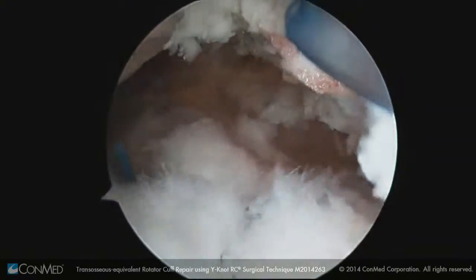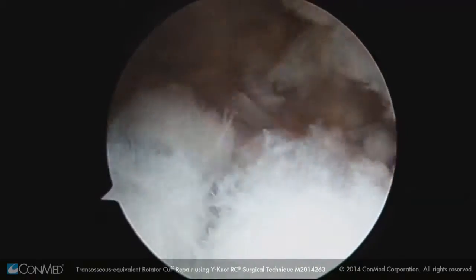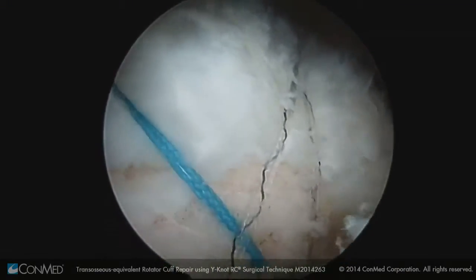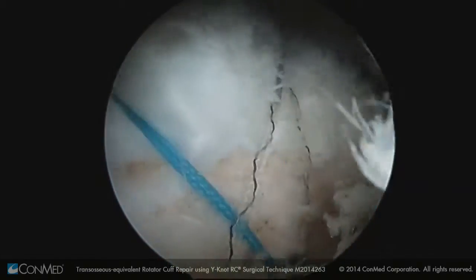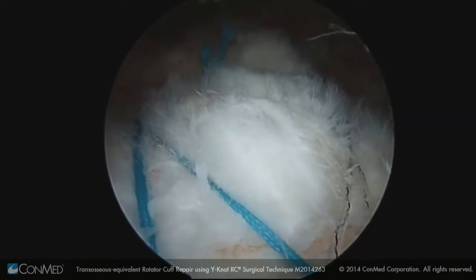Now we've completed our repair of this medium-sized, full-thickness crescent-shaped tear. It did have excellent mobility, so it was an appropriate candidate for a transosseous equivalent. We can see we have excellent compression and anatomic repair with no dog ears.